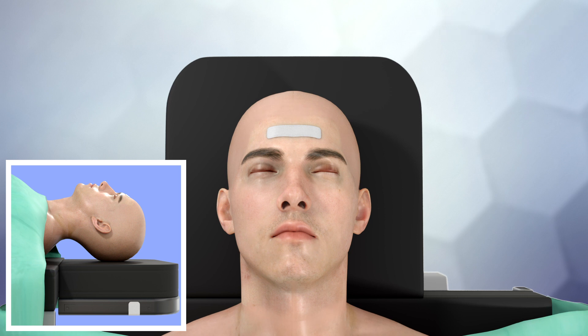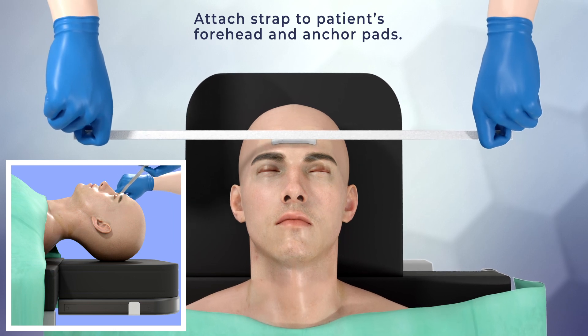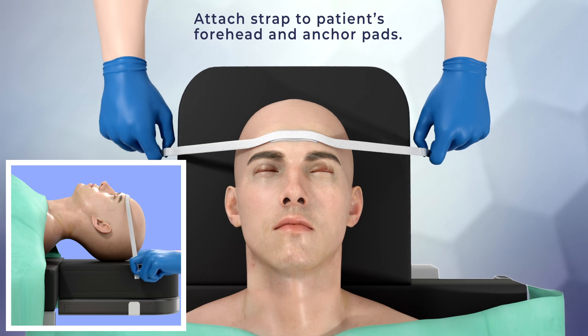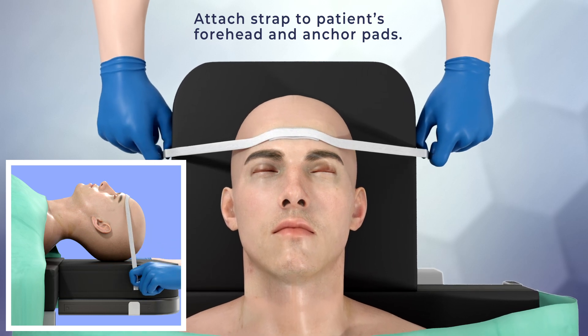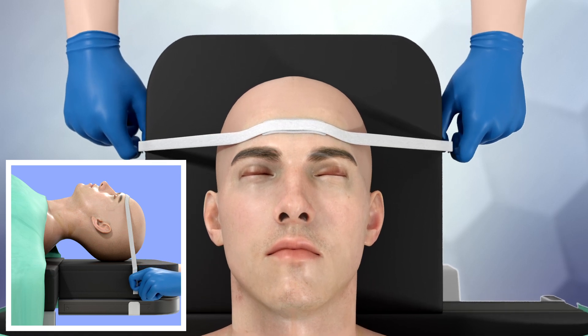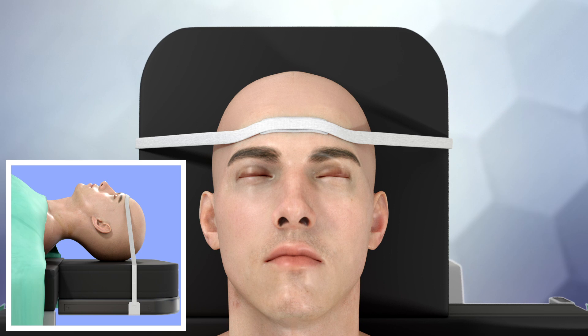Using both hands, grab each end of the strap and pull in a downward motion while attaching the middle of the strap to the anchor pad on the patient's forehead. Once the strap is in the desired position, pull downward on both ends of the strap and attach each end to the anchor pads on the left and right side of the bed or table, ensuring there is equal tension on both sides of the patient's head.